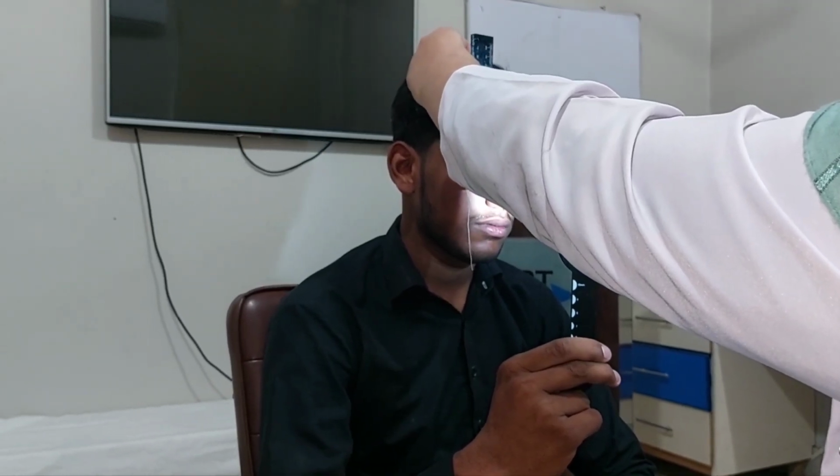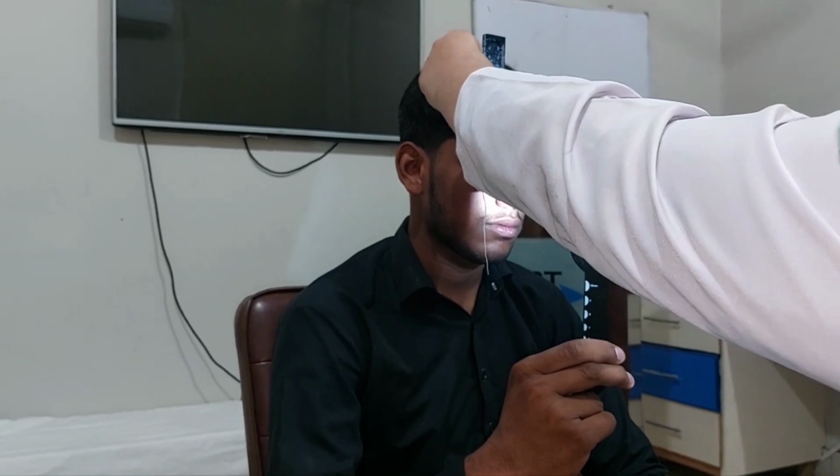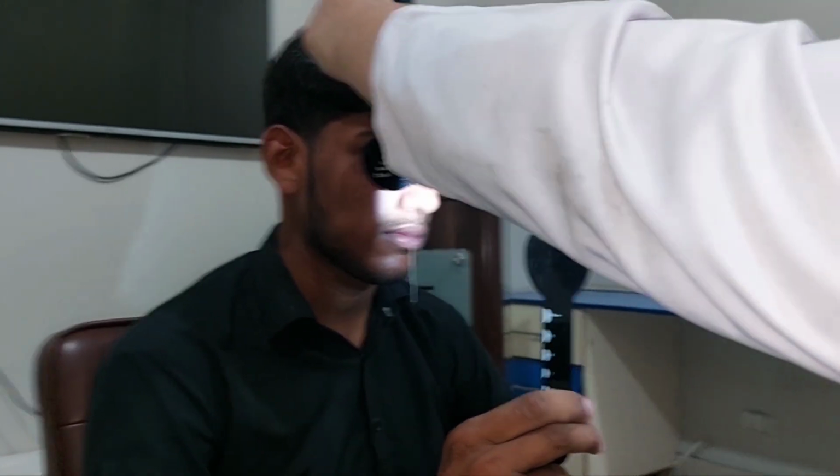On covering the right eye, the left eye does not take up fixation, indicating that the patient has poor vision. So now we'll perform the prism cover.